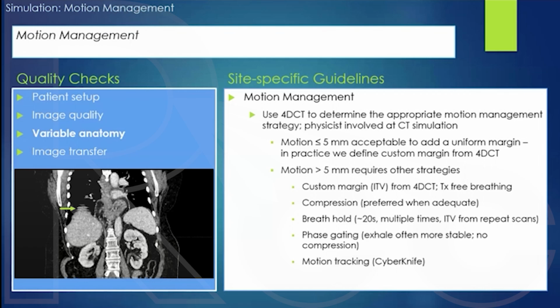So avoid registering to an entire field of view, which will definitely be inaccurate if your patient is set up differently between your CT scan versus your MR or PET. But if you do the target alignment for the full registration, it will still be usable.